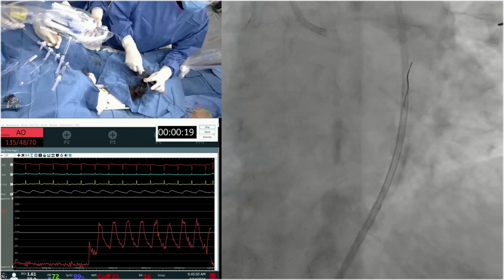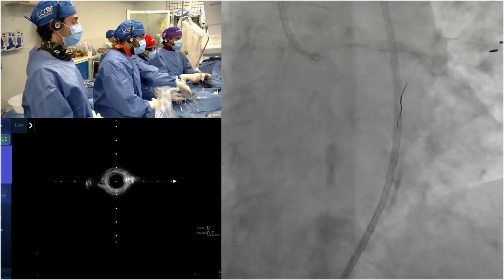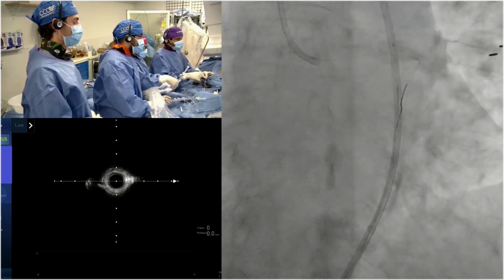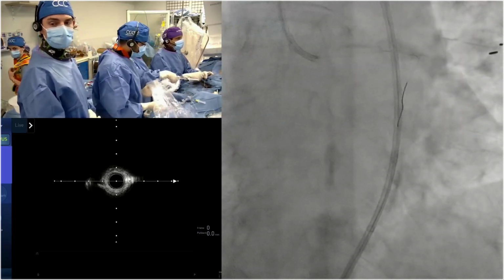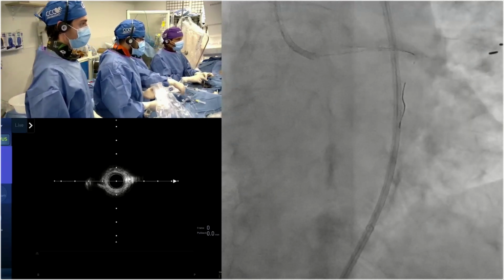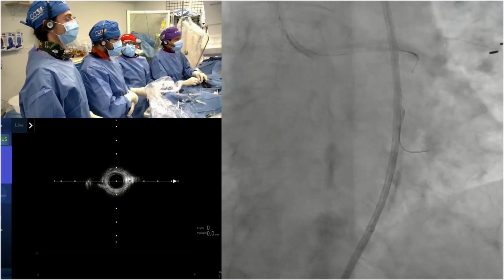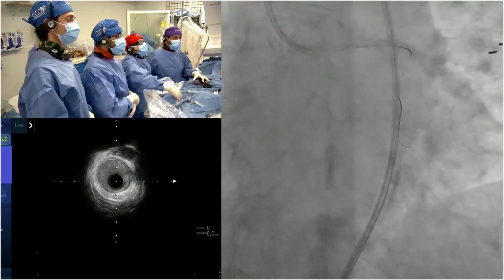Well, this is kind of interesting and juxtaposed to the previous case, that we've got somebody who's having a complex left main, ostial and potential involvement in the bifurcation. They were getting ischemic time with the rotablator, we're getting slow flow, but we're not using an Impella. Yeah. And clearly there's a gray zone. It's a randomized trial here. One room used the Impella, the other room didn't. Yes, you got your own randomized trial.